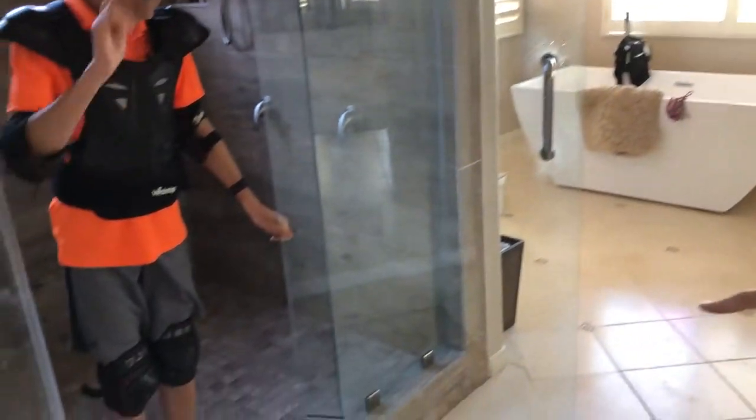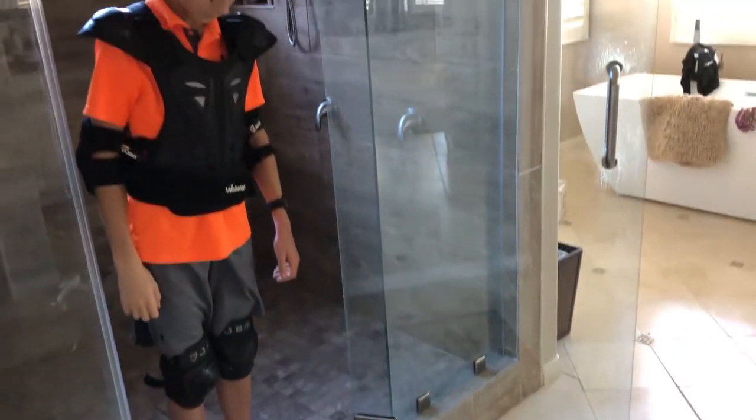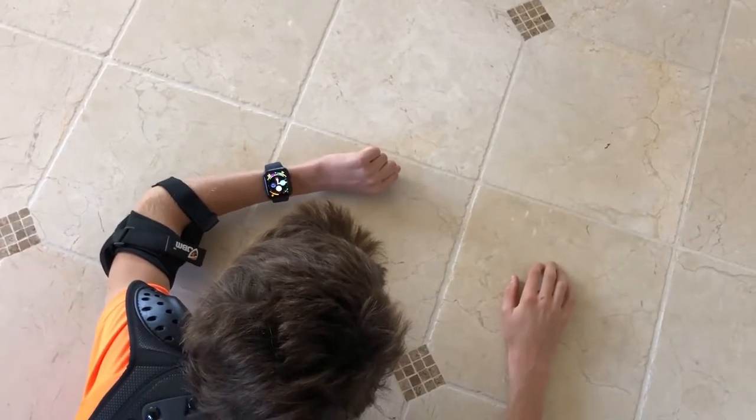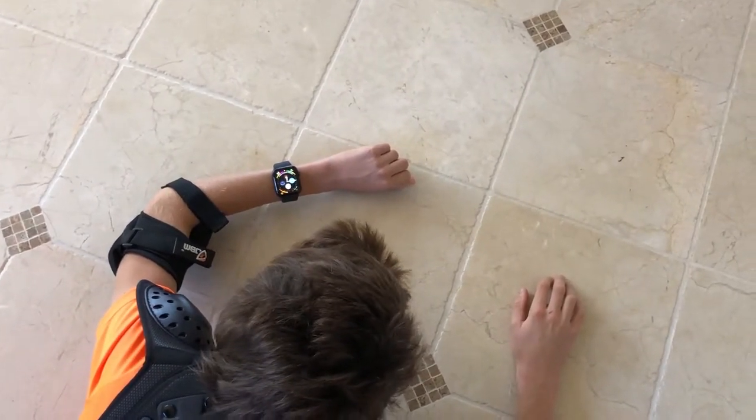Now we're going to test coming out of a shower with a low threshold — that is a low step over coming out of the shower. Andreas, go ahead. We're waiting for a response, and so far nothing. That is a negative response.